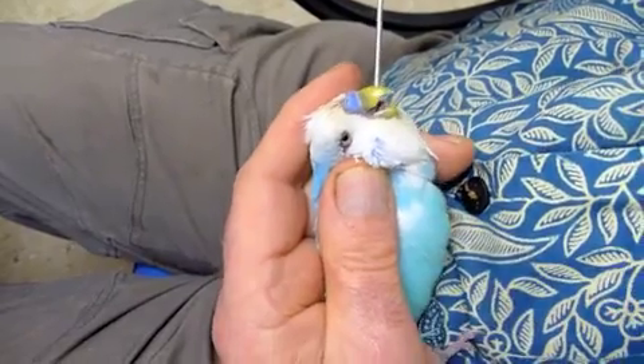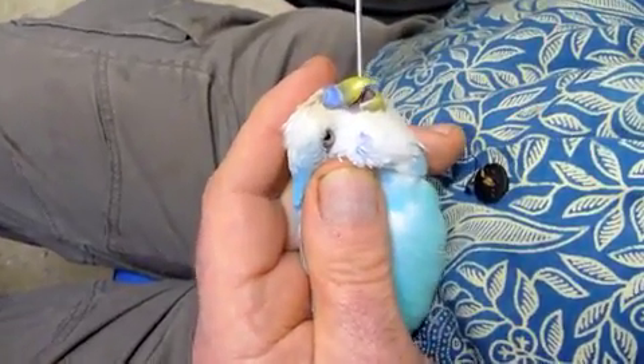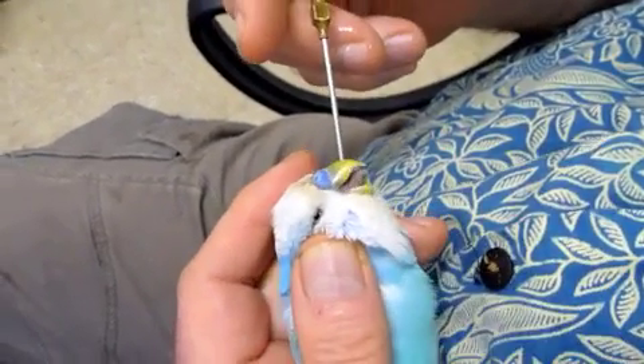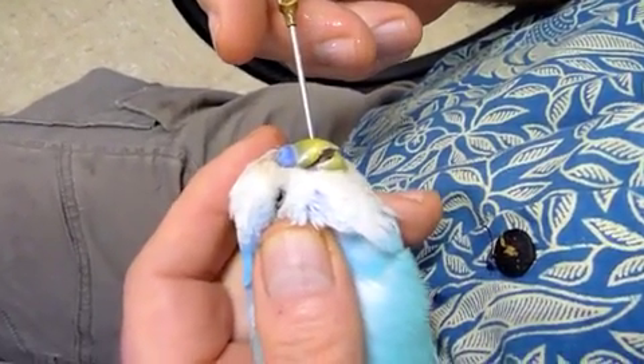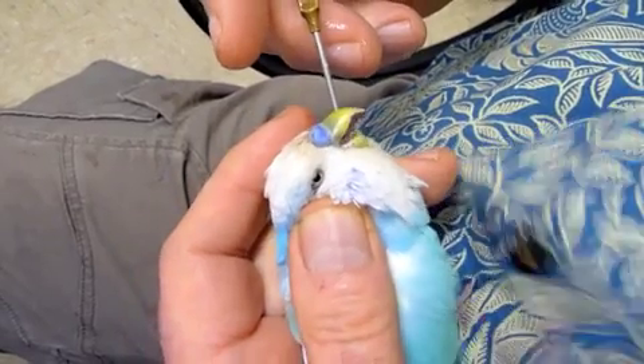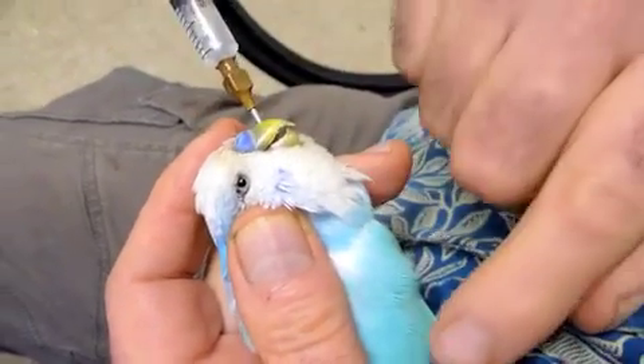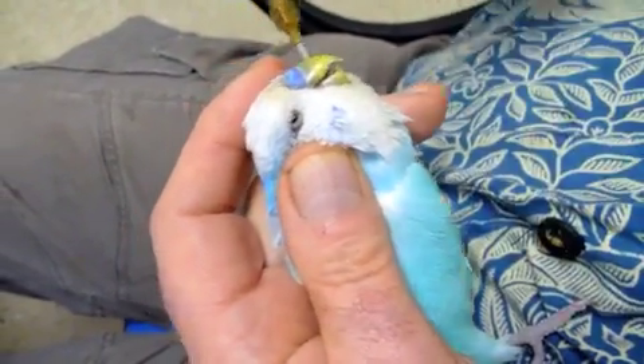I'm putting the crop tube over the base of the tongue from the left side going across to the right side. I'm sliding it down without force; as he swallows it's going down under my thumb. I can feel it passing under my thumb and I'm feeding it down until it's at the level of the crop, which is here at the base of his neck.